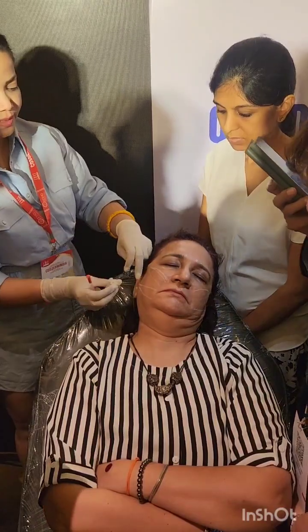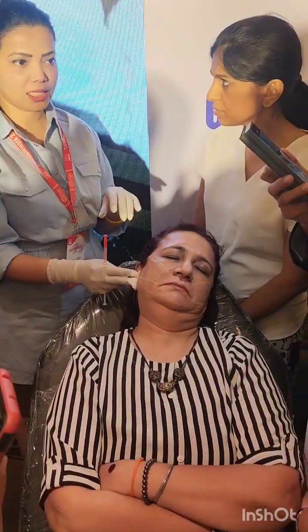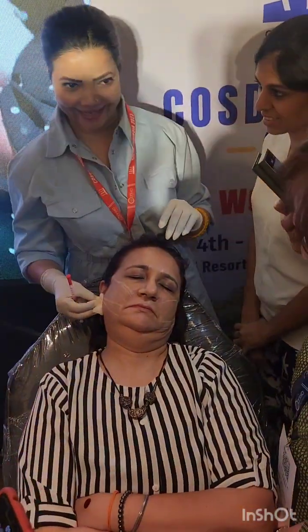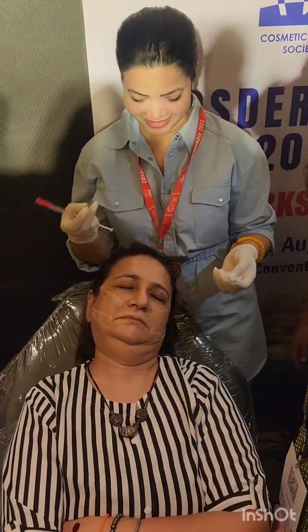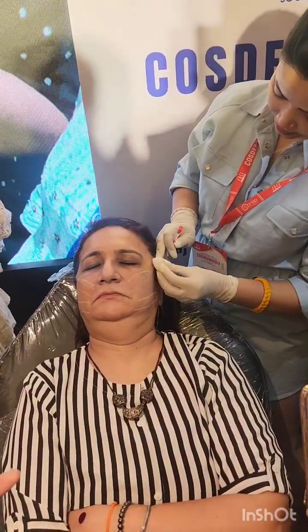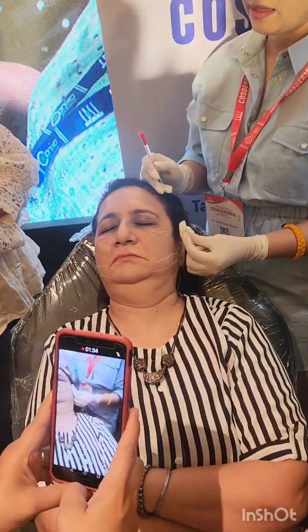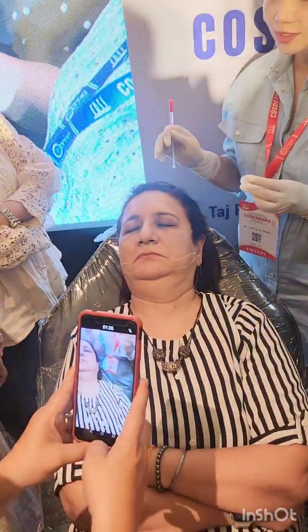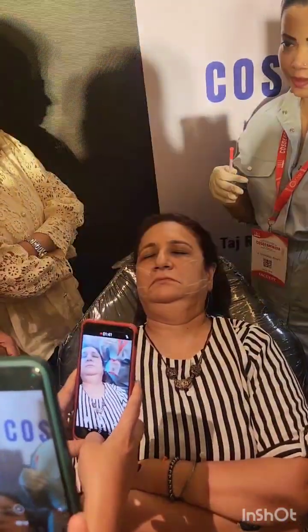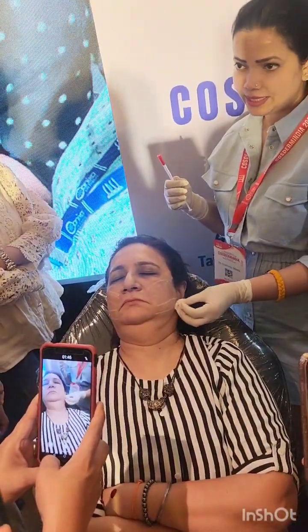So now the other side, because how much time does it take for anesthesia to make it bloodless field? Anyone? 7 minutes to be exact. Each time sterilize, make it a habit. Whenever you are doing injectables, obviously you are not sterilizing your wounding as you do for hair transplant, right? So each time you are injecting, always keep sterilizing the area.